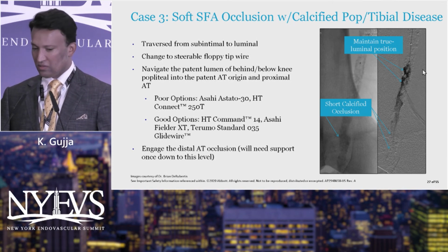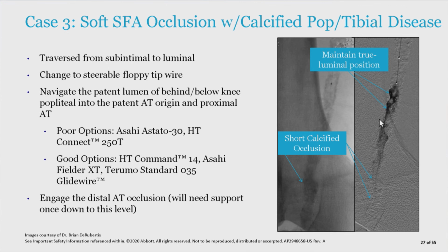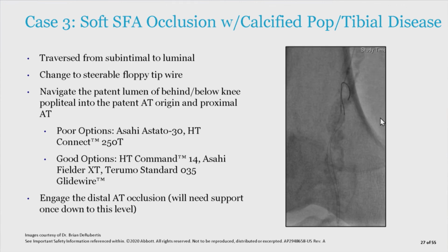So this case started off with an 014 wire, right? Because this case is a good case to start off with an 014 wire. 014 wire is great to start here because it's a short occlusion you can get through, and you know that you can get through, balloon it nicely, probably with a shockwave now, and then put a Supera in there.